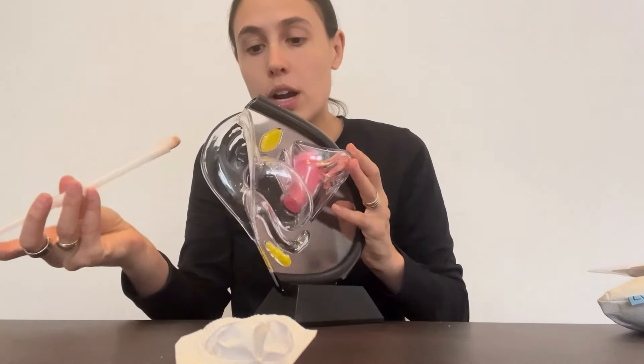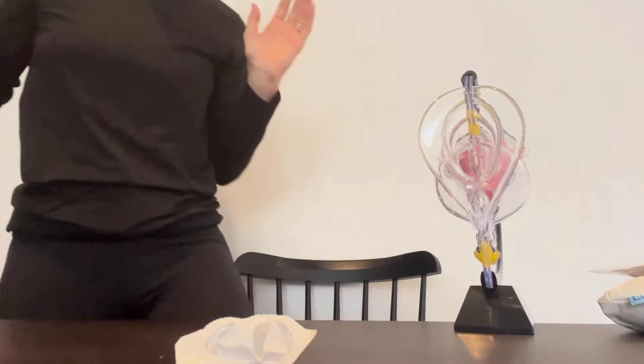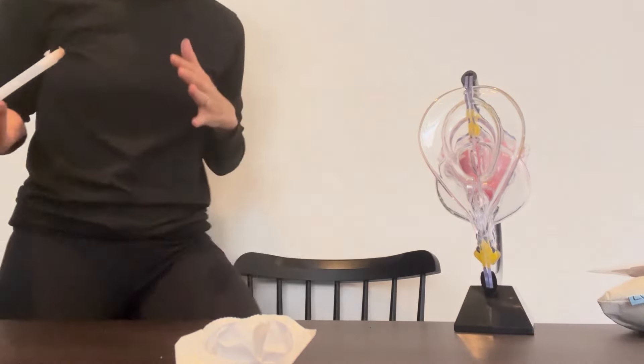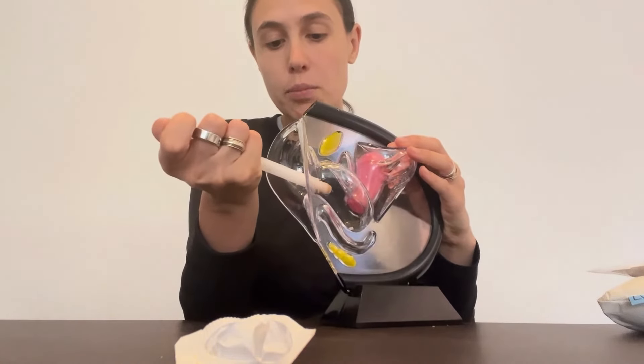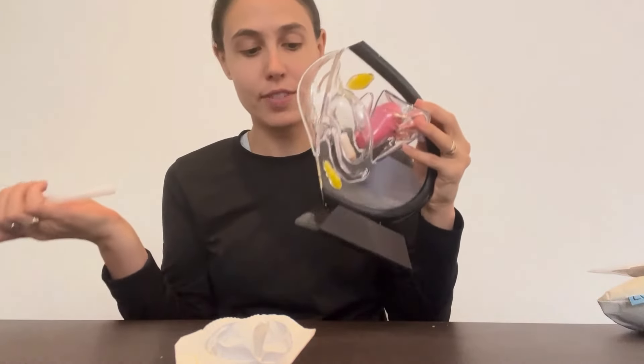Then you're going to insert this into your vagina. Sometimes you can stand up and put your leg on a toilet seat or a chair or a table — that sort of opens your vulva a little bit so you can have an easier time putting something in. So as you can see, the treatment is inserted into the applicator, and you're just going to take this and slowly press it until it gets into the vaginal canal.